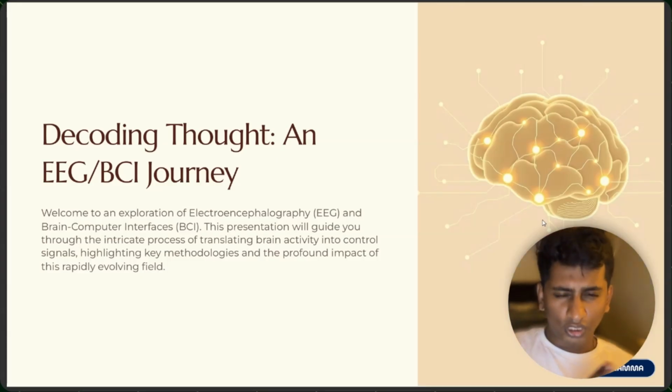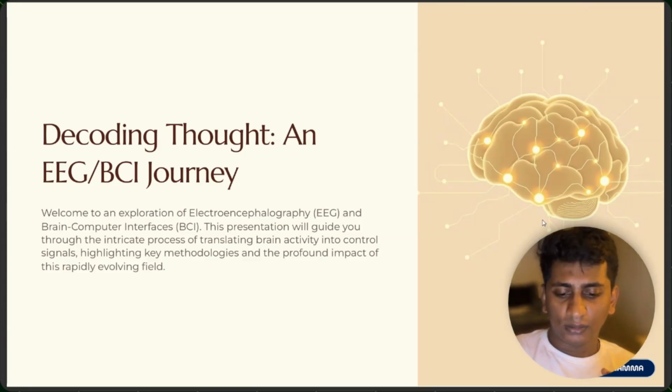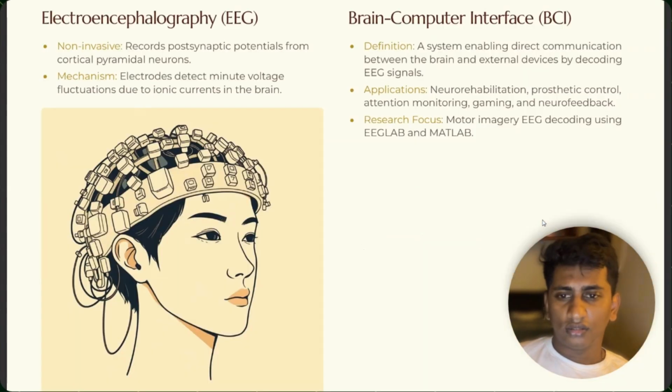So basically, before going to the concepts, I think by this time you know what EEG is. It's the brain's electrical activity recorded through scalp electrodes. It captures oscillations in the microvolt range, reflecting the synchronized activity of a large population of neurons. So for BCI, EEG is usually used as a non-invasive, portable, and relatively inexpensive signal source. So yeah, we'll go to the next thing.